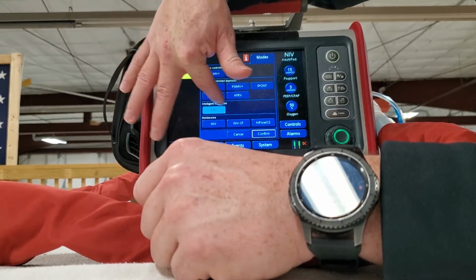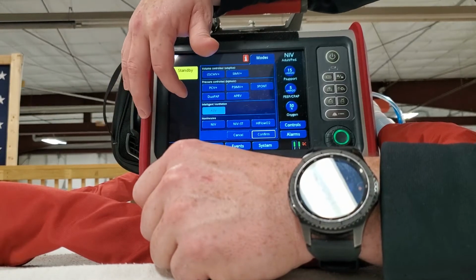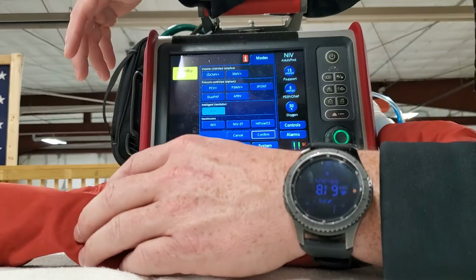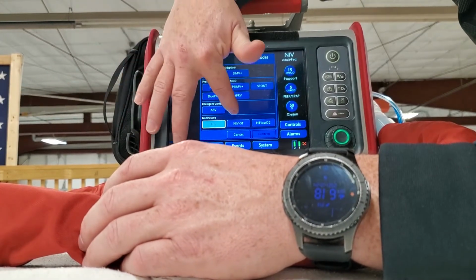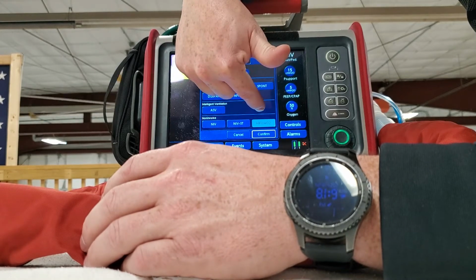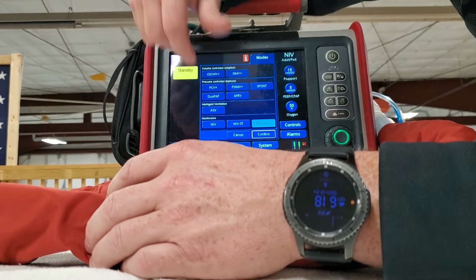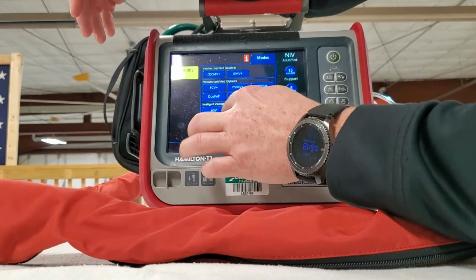And then the ASV, this is a Hamilton design specific ventilation mode, and we'll talk about it as well. It's a very useful tool, especially on super sick patients. You can't just figure out what's going on and you need to get some time to think. And then your non-invasives, which we'll talk about too. But I know that we got high flow right here. Chief's in the process of figuring out how we can do these high flow 40, 50, 60 liter per minute patients, and that's where you would go from here.